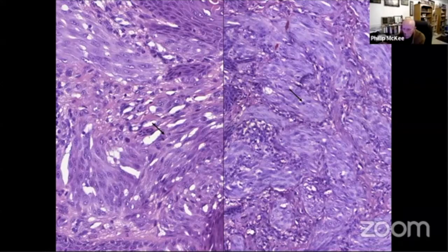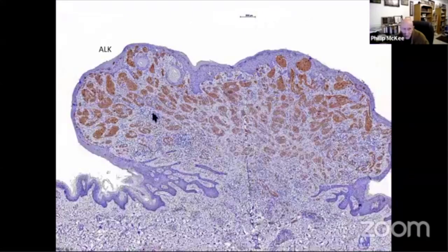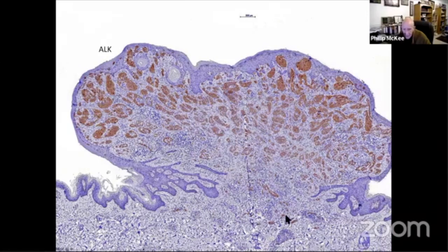That's the base of that lesion. Isn't that beautiful — that's ALK staining. Not only can you see the expression of the protein, but it's also a very clear demonstration of maturation, with the nests getting smaller and smaller at the bottom, down to single cells. You can look at that immunohistochemistry and you don't need the H&E — if you just had that slide alone, it would do very well. You can say this is a spitz nevus, and that's the end of it.